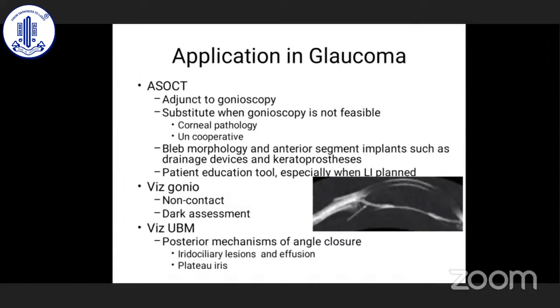Yes, this is a special application because the treatment of drug-induced glaucoma versus primary angle closure glaucoma is absolutely poles apart. So if you suspect drug-induced glaucoma and you don't have UBM, please refer to a center which has it in the neighborhood, and it can pick it up very easily.